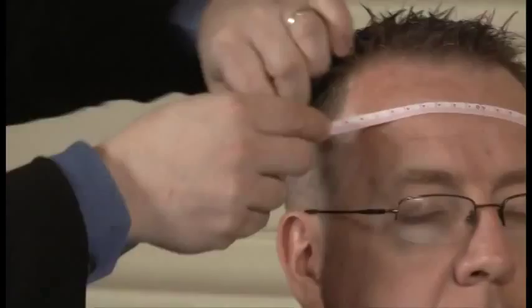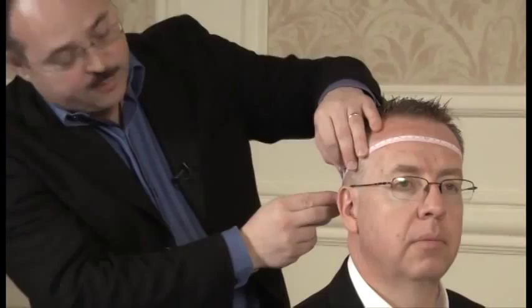Use about four to five cc's of gel. We'll go ahead and measure for the right cap size. You start about an inch above the eyebrows, follow the cap around. It's 58 and a half centimeters. Then you take the cap and check on the inside tag. It's 58 to 62, a perfect size.